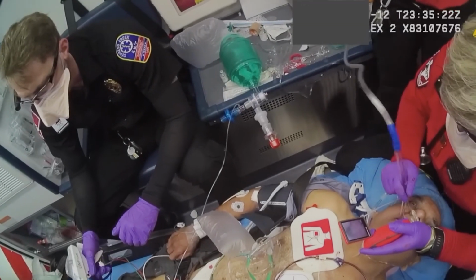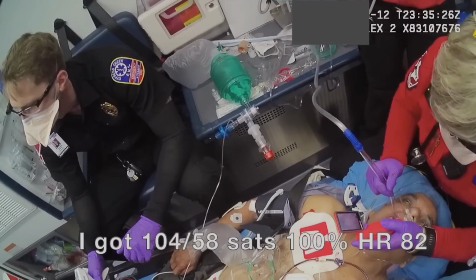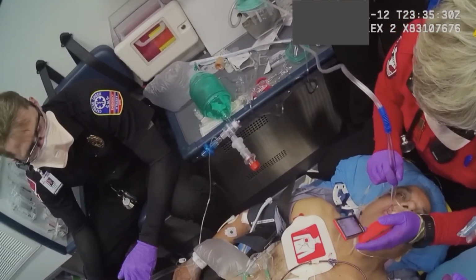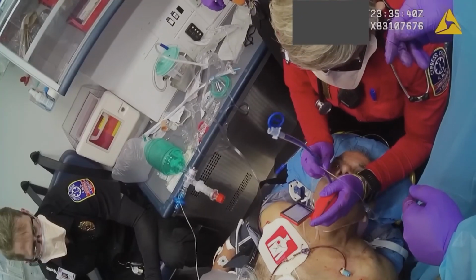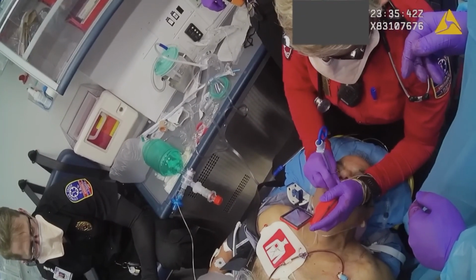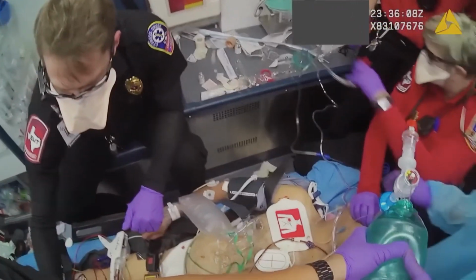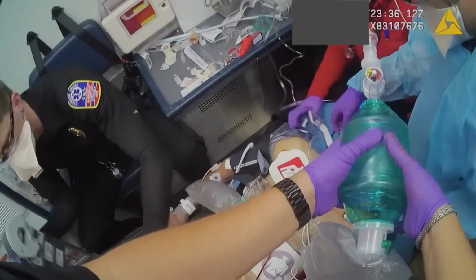TXA, do you? No, sir. All right. I got 104/58, that's with 100%, heart rate 82. All right, epiglottis. Let's go a little deeper. There you go. All right. Sure. Coming out. We have an end-tidal waveform over there. Yes, sir. End-tidal 43, good waveform. Excellent. I'm going to take this cannula off.